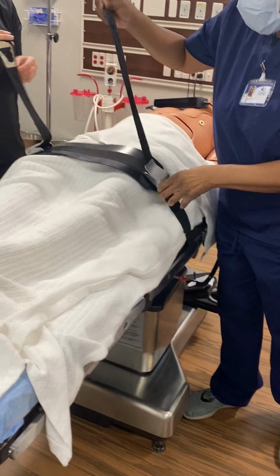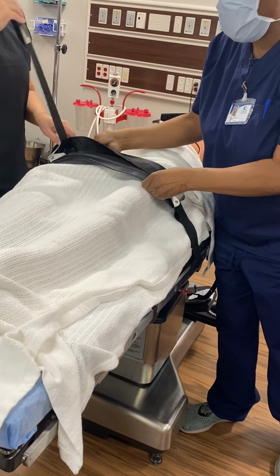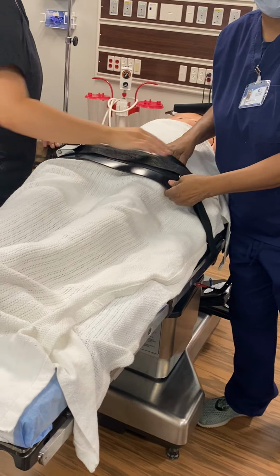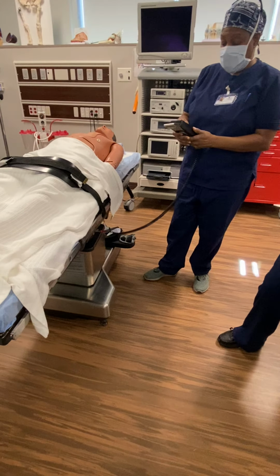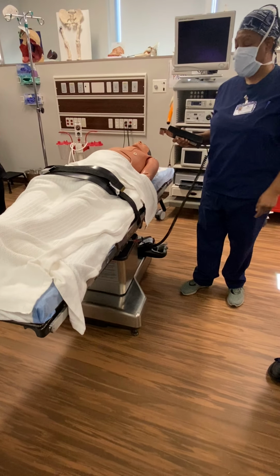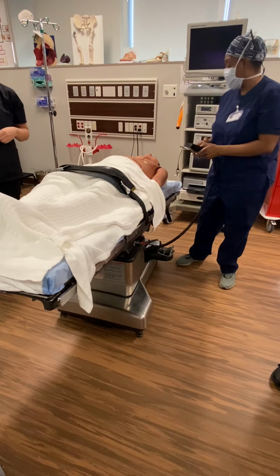And we're going to turn the bed this way. Then pull it snug, not too snug, because you don't want a pressure sore or anything, okay? Same thing, depending on the patient's size, we're going to do Trendelenburg again, so the patient's not going to slide out. The head may slide forward.